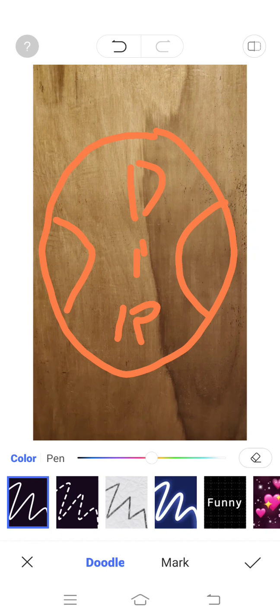Okay, so this part here is the distorted area. What do you mean by distorted area? That means this is the area that has a lot of astigmatism. This is the weakness of all progressive lenses. Now they have this distorted area on the side.